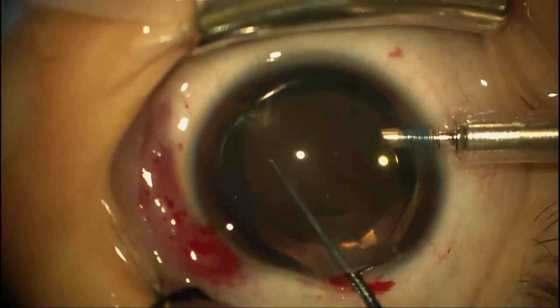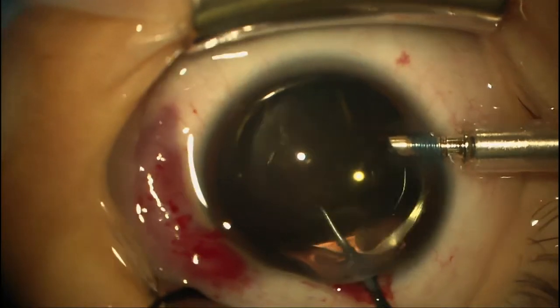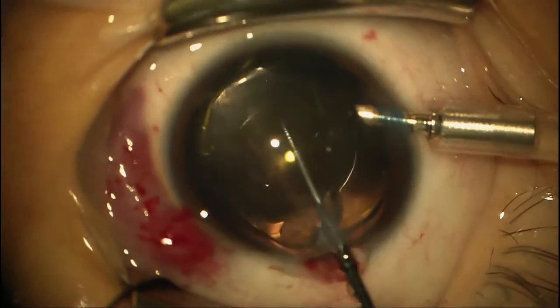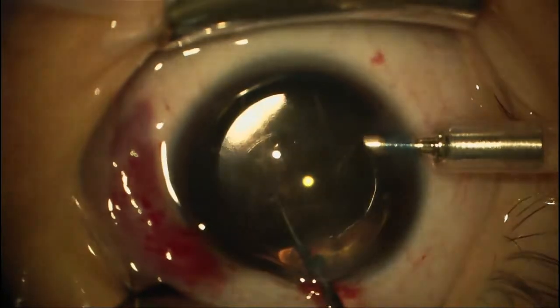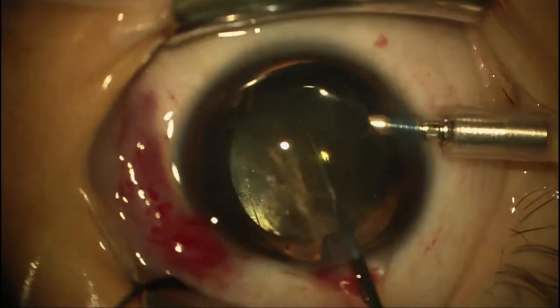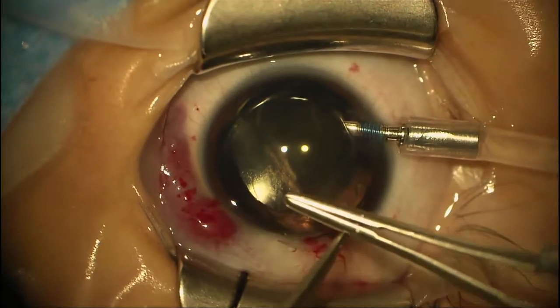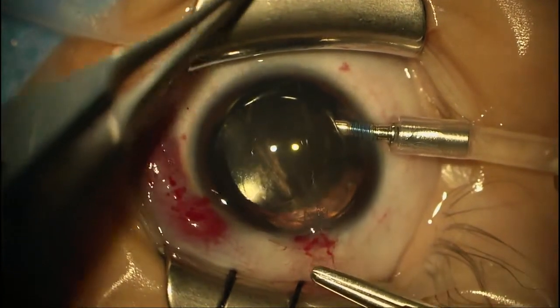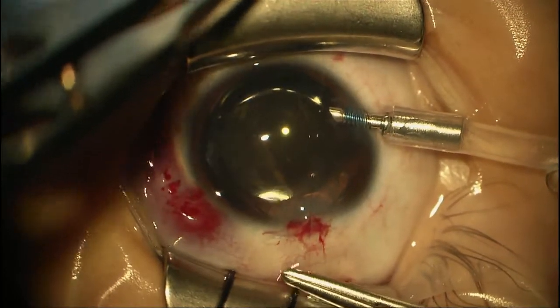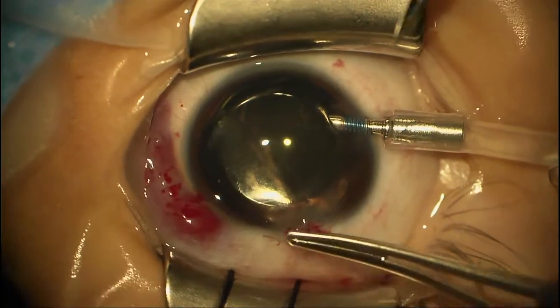I've got my suture in and I'm going to dial this lens just a little bit more. These haptics don't really put much pressure on the bag, but if you have any pressure you want it closer to where the irregularity is. I'm going to finish this rotation, then close this down, get our viscoelastic out, put in a little Miochol to bring the pupil down — everything we can do to help stabilize that implant.